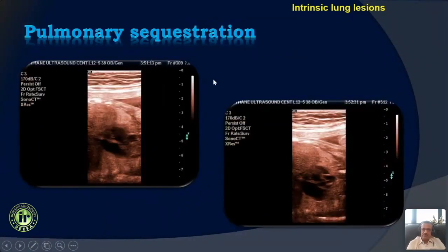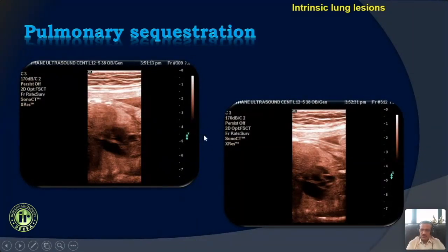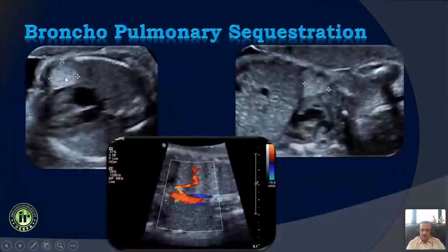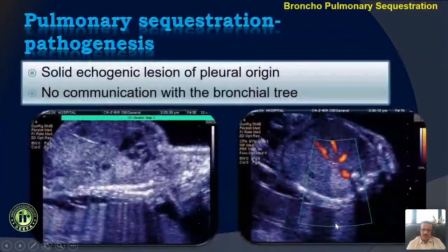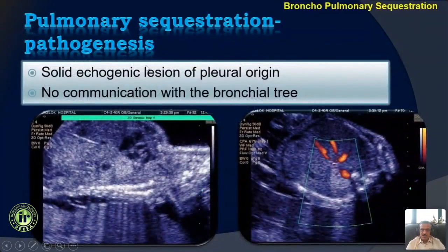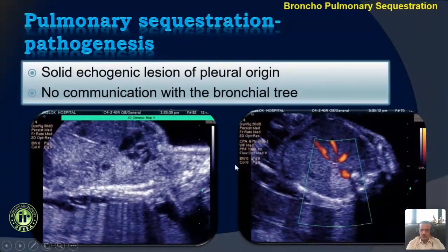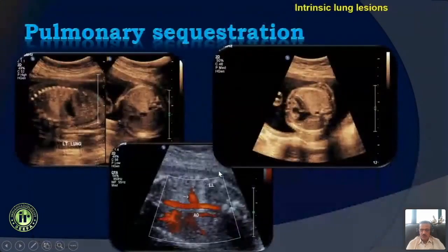Compared to CPAMs, the other pathology we see is pulmonary sequestration. Here the lesions could be small, very often close to the diaphragm, and often triangular in shape. The diagnostic feature is blood flow coming from a systemic vessel like the aorta. These are solid ecogenic lesions thought to be of pleural origin, and the key difference is that there is no communication with the bronchial tree.